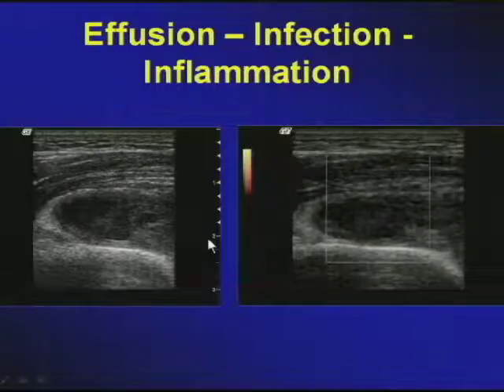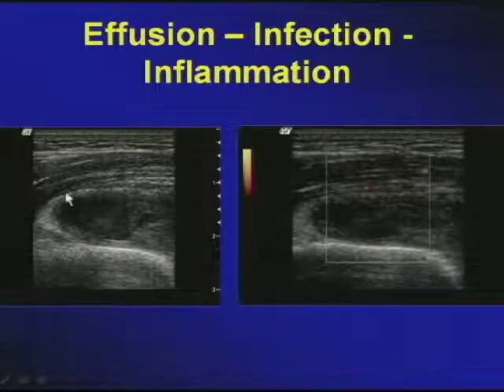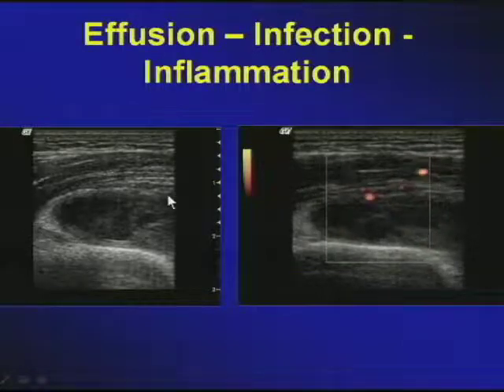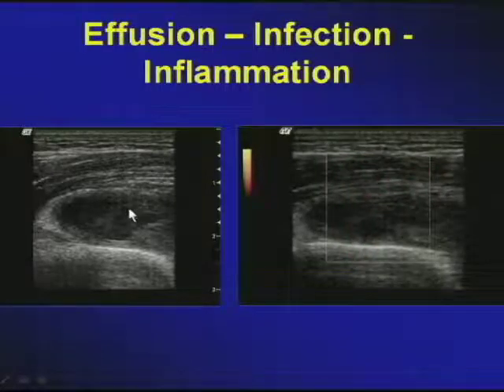If you add ultrasound, immediately you can appreciate the distended olecranon fossa. And here, not only do you see the fundus quite ballooned, but also well within it, you get to appreciate the fact that there is some proliferative synovia in grayscale.